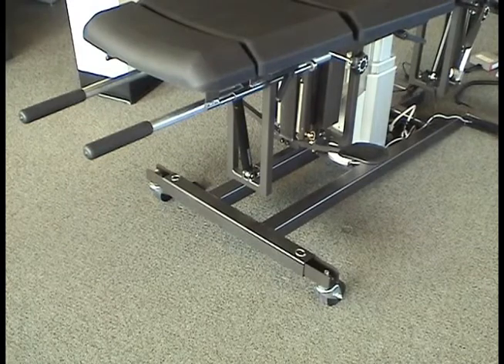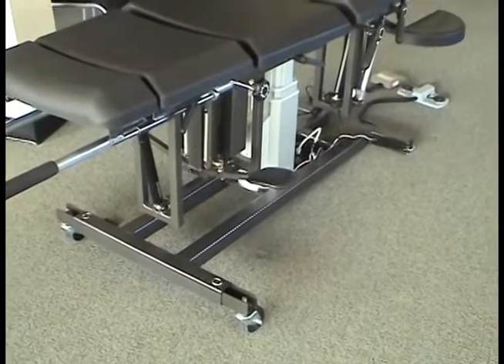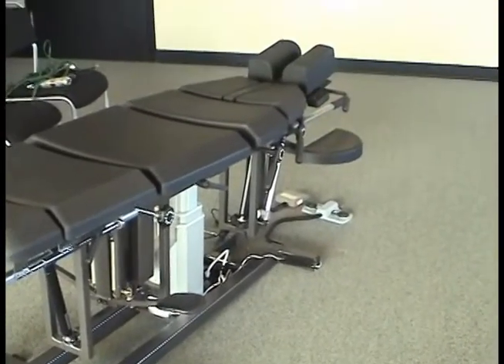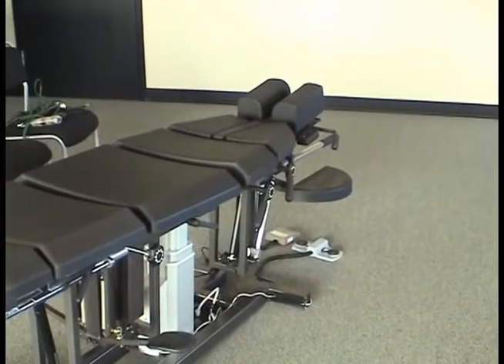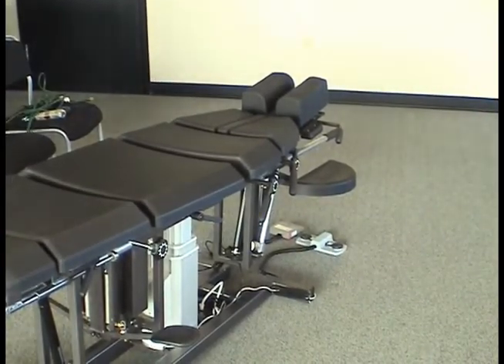When the frame is flush to the floor, the table is 21.5 inches tall. There are 4 brass adjustable feet in the cardboard box that can be used to raise the table an additional 1.5 inches approximately.